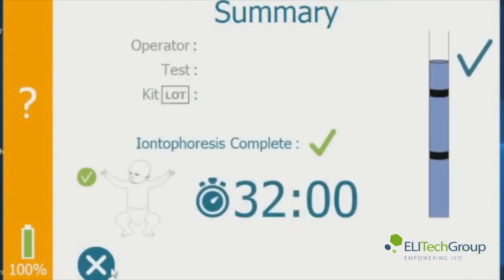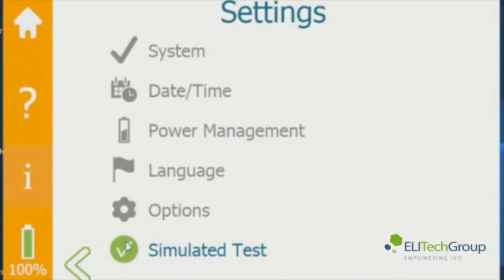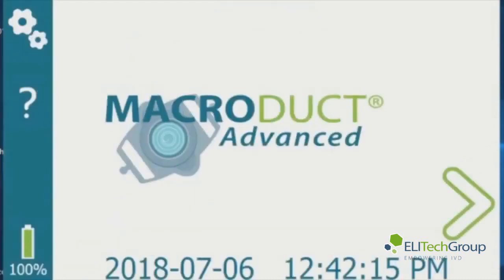The summary shows you that you had sweat above the second line and everything is good. Turn the simulated test off, go back home, and that is the introduction of this instrument. Thank you.